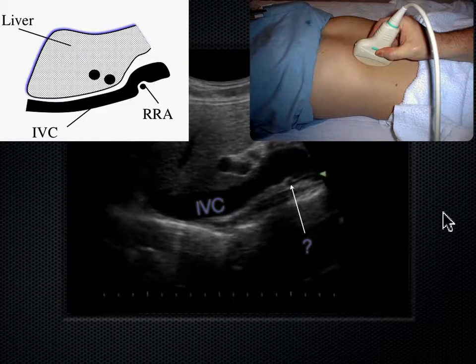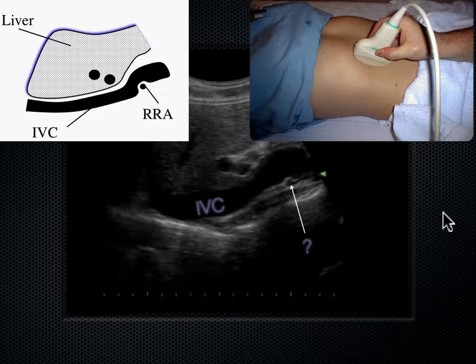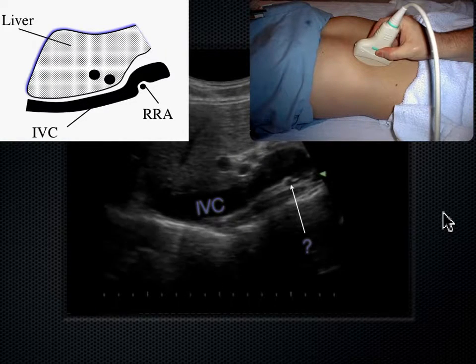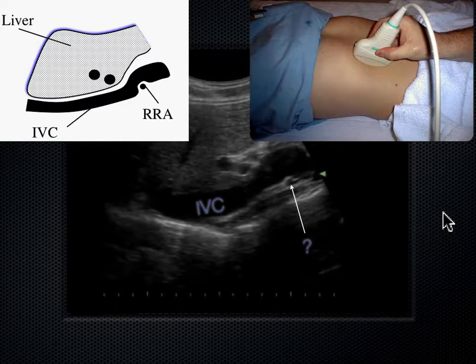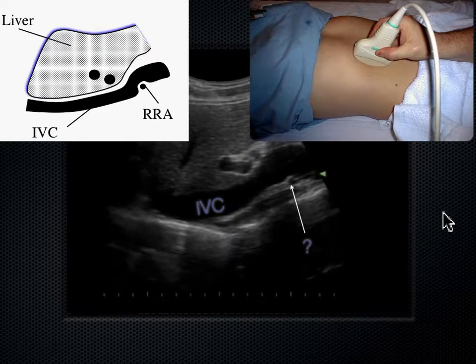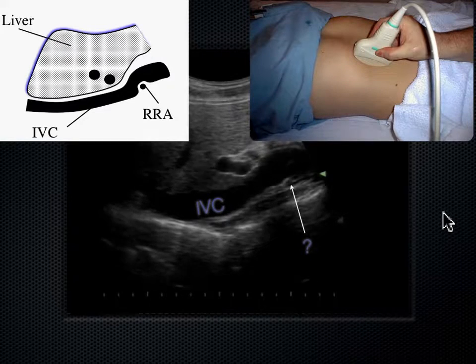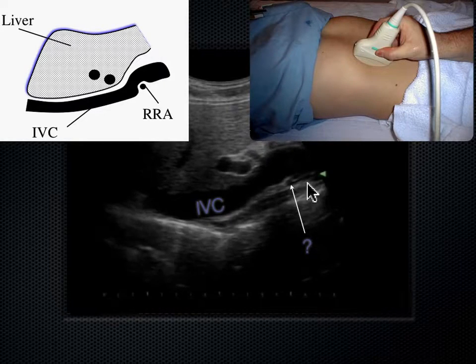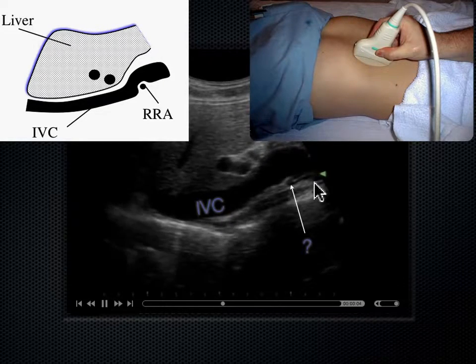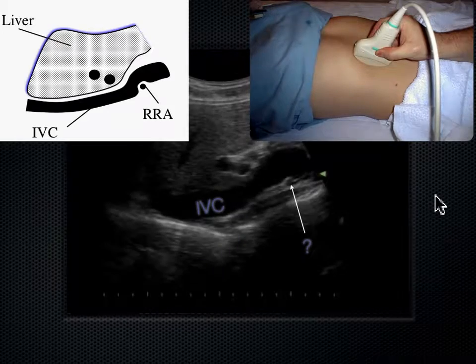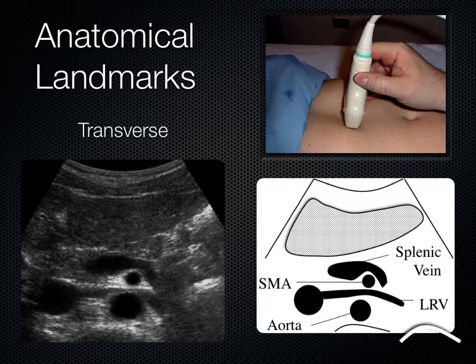What's happening is the blood is trying to get from the aorta on the left side of the body all the way over to the right kidney on the right side. The way it does it is to go behind the IVC. That's just a landmark we see a lot on ultrasound.